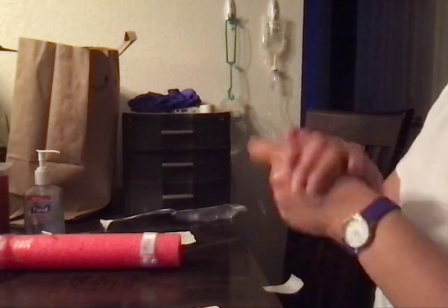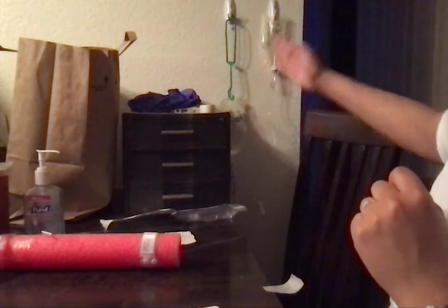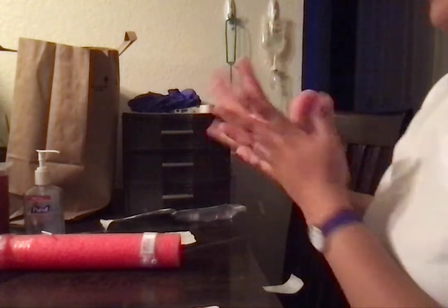Going to wash my hands and put on gloves. Also, I didn't verbalize it, but I put the main line down because the secondary line has to be higher than the first line.